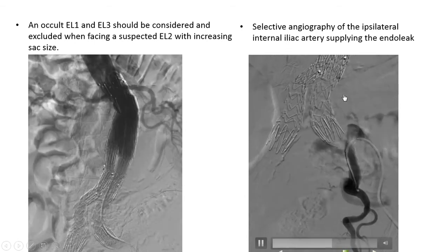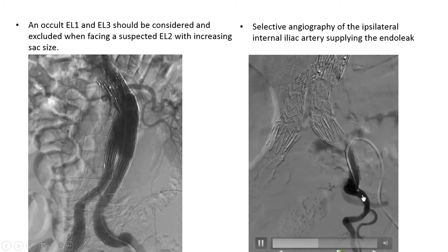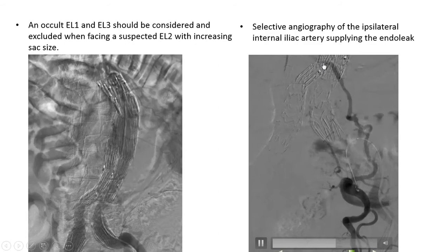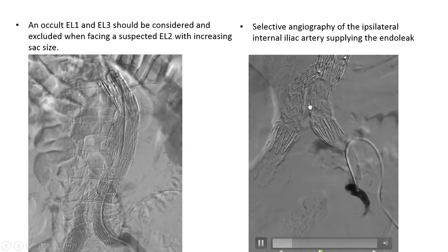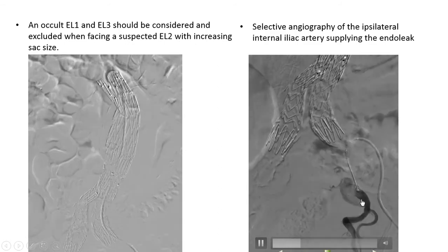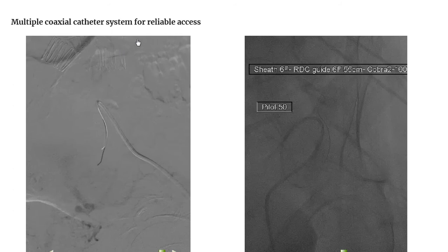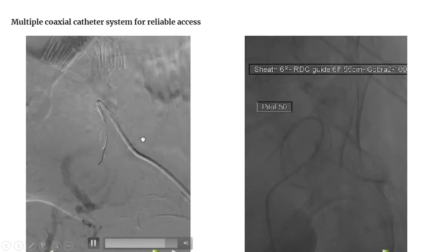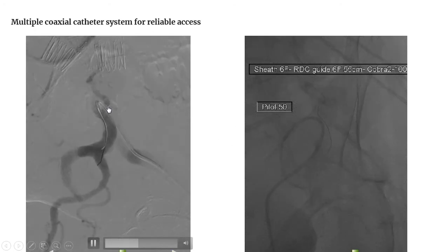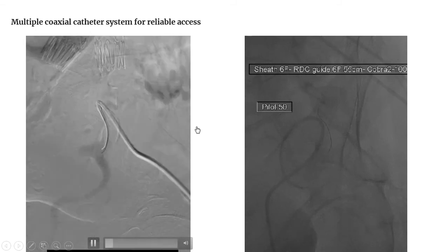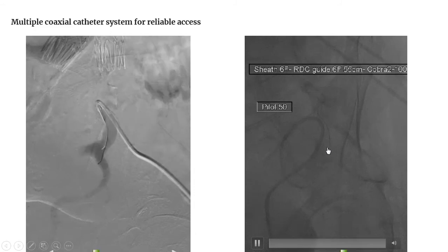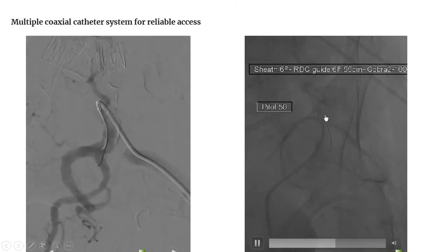Selective angiography of the ipsilateral internal iliac artery supplying the endoleak is seen here. You can see the iliolumbar artery and the lumbar artery draining into the aneurysm sac. A multiple coaxial catheter system for reliable access was applied: we used a 6 French sheath, an RDC guide 55 centimeter, a Cobra catheter 100 centimeter, and a Pilot 50 wire to access the iliolumbar artery.